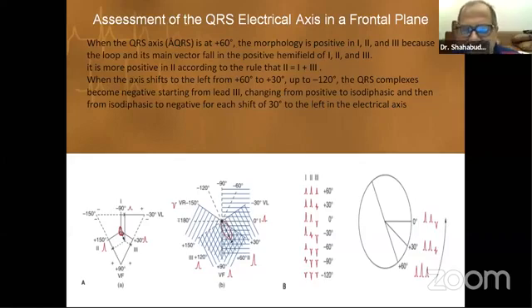This is a very simple thing. If we concentrate very minutely on these things, we can understand how the deflections in the leads change as the rotation of the axis takes place. Here, these are the intervening angles. This is lead 1, and this is lead 2 and lead 3. Lead 1 is directed along its central position, that is the 0 position.